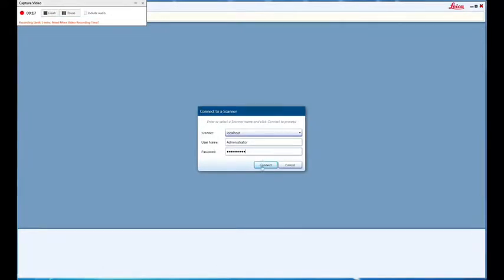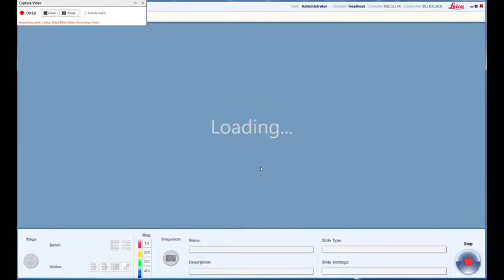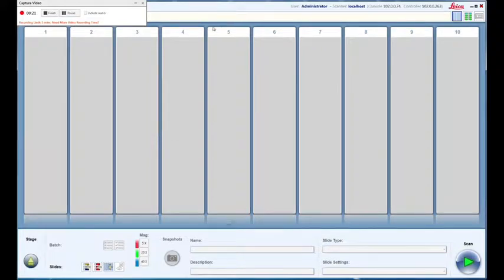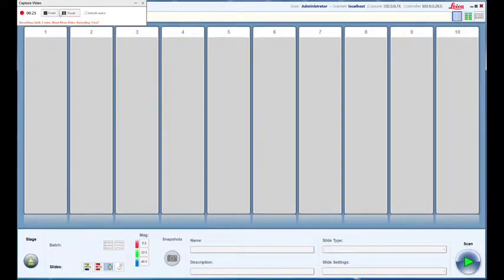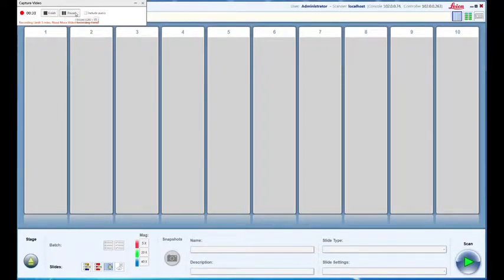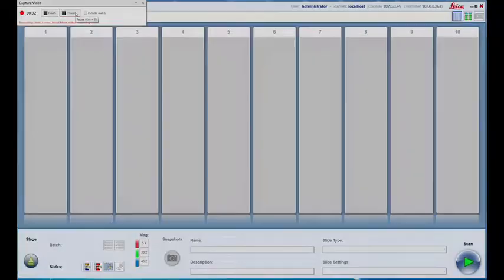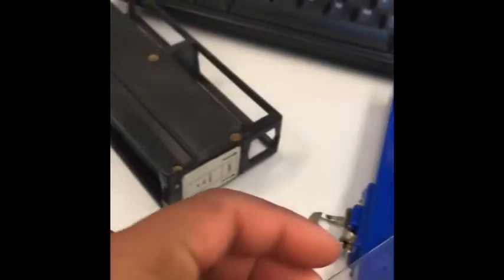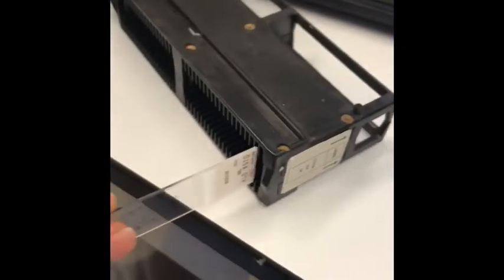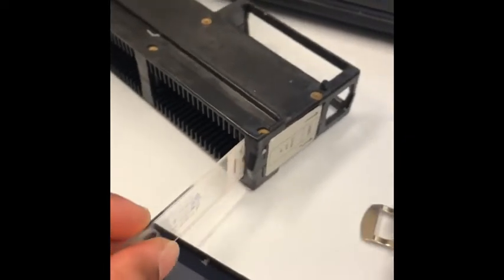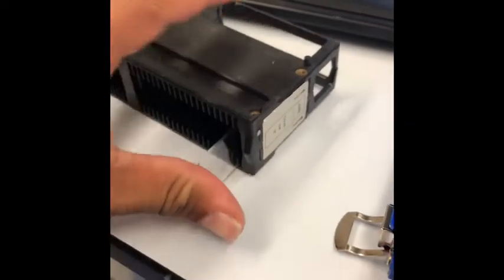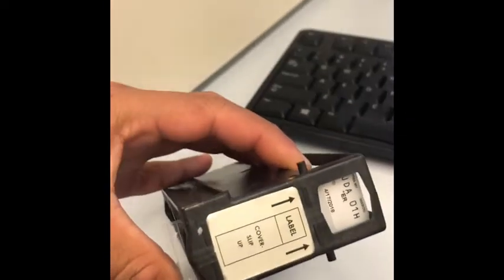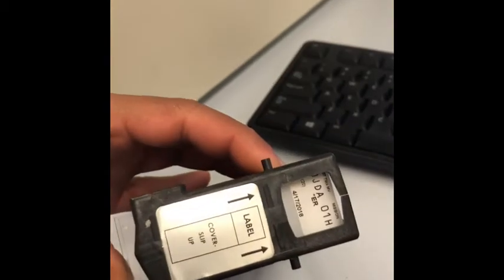Nothing has been loaded yet, so I'll begin loading the basket, which can hold up to 40 slides. With the baskets, you're going to want to load with the label facing in, as shown here on this little clip, and you'll start from the top. There's two labels.